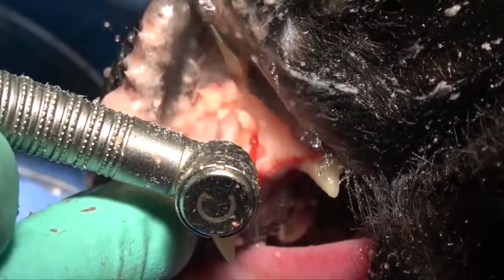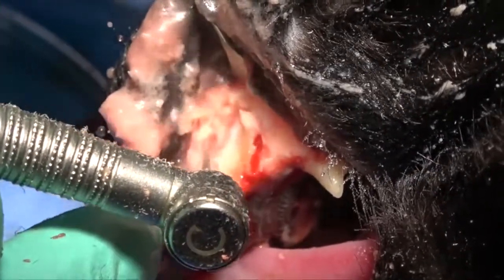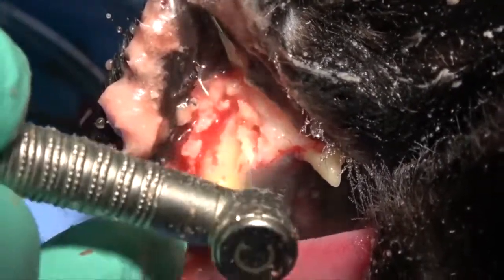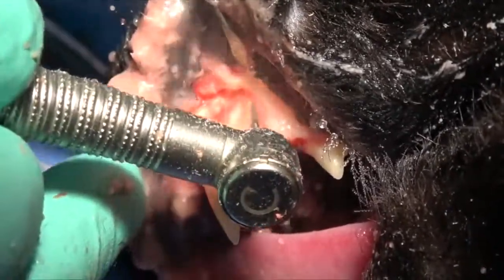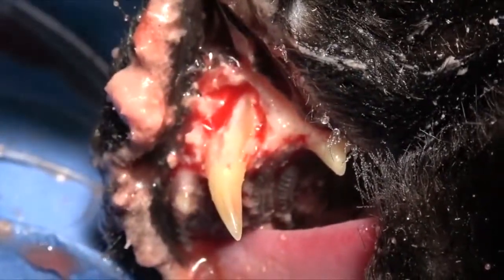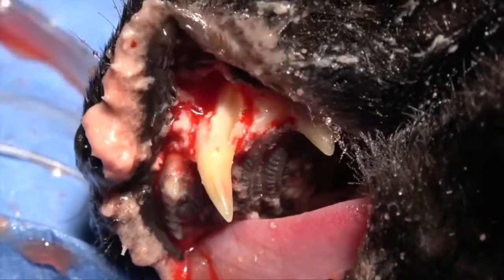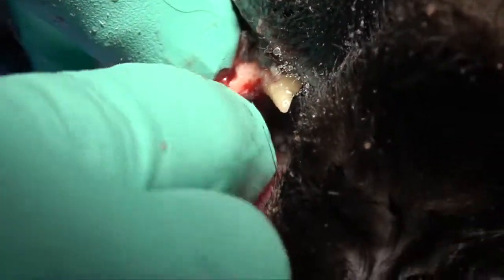We're creating a groove on both sides of that canine tooth. You can see how easily that burr gets into that tissue just because of the expansion. That bone is very porous and very weak, and very quickly we can create that outline and go directly to luxation in many cases.